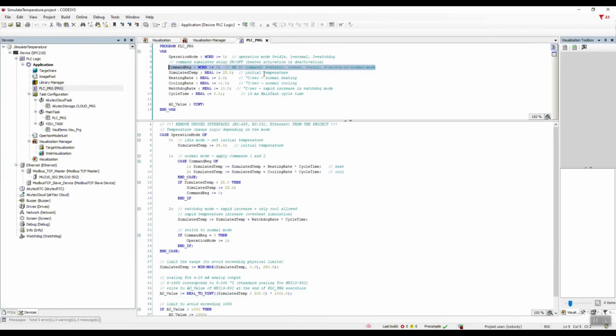Emulator command for simulating various processes in the sterilizer, for the normal operating mode of the emulator. 1. Simulation of heating, that is, increasing the temperature inside the sterilizer. 2. Simulation of cooling, that is, decreasing the temperature inside the sterilizer. Simulated temperature inside the sterilizer. Heating rate, that is, the rate of temperature increase per second in normal mode. Cooling rate, that is, the rate of temperature decrease per second in normal mode.